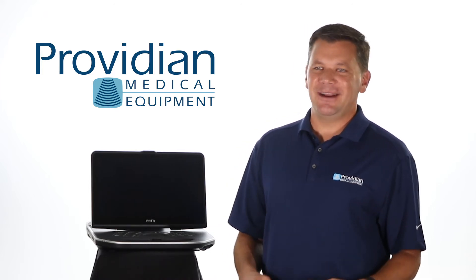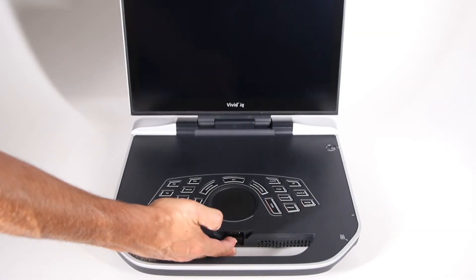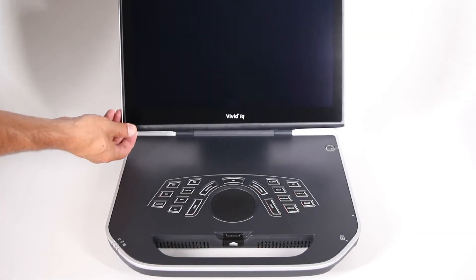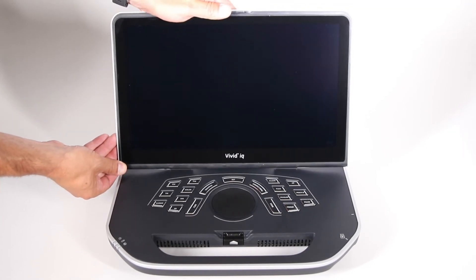Another bonus on this machine is, frankly, it just looks really cool. And to be honest, this cool factor gives an added bonus because it gives constant confidence to patients. When you look at it, it really just feels good when you use it.